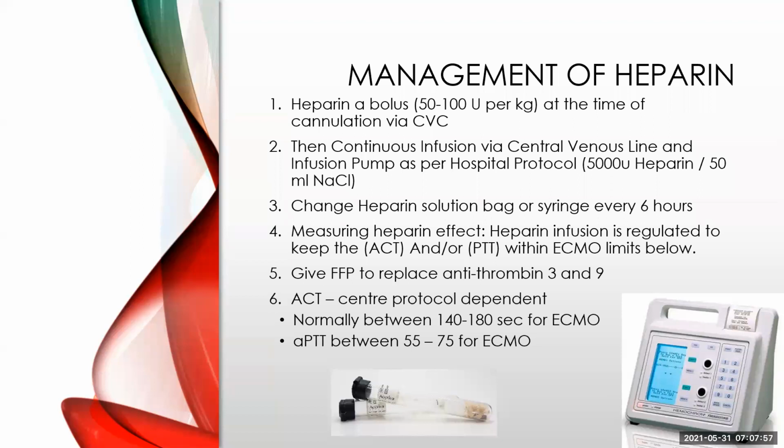So it's necessary for you to change the bag or the syringe that you've mixed the heparin in every 6 hours. And it doesn't help that you make all your bags in the beginning of the day. You have to change it every 6 hours because the heparin clings to the plastic of the bag, and then your heparin solution becomes very unstable, and then your anticoagulation is not going to be properly managed.